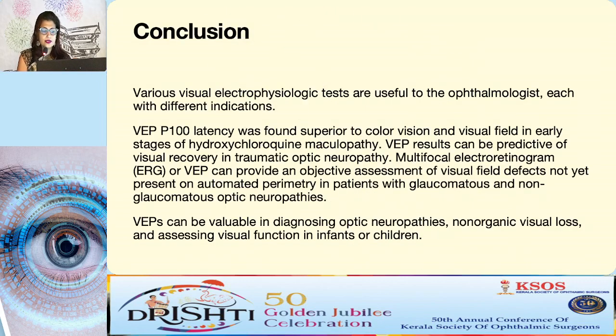So in conclusion, the electrophysiological tests are an important thing in your armamentarium. You may not be able to use it all the time, but in some conditions, it definitely gives us an edge over our clinical examination and our other functional tests that we do.